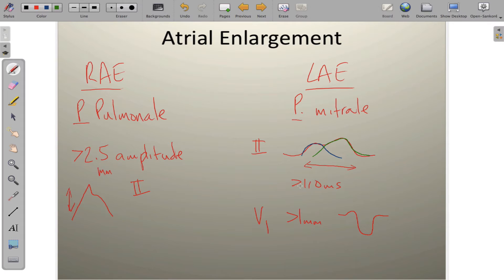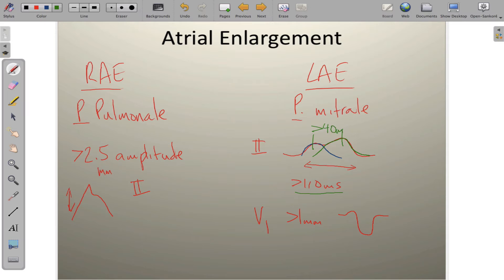The overall P-wave duration exceeds normal, reaching greater than 110 milliseconds. Because there's more muscle mass or tissue, we also get a change in amplitude, appreciated in lead V1. This M-shape appearance is P-mitral — left atrial enlargement. Also noted in some rule books is that the peak-to-peak difference must be greater than 40 milliseconds, meaning there's a delay between the start of right and left atrial depolarization of greater than 40 milliseconds.